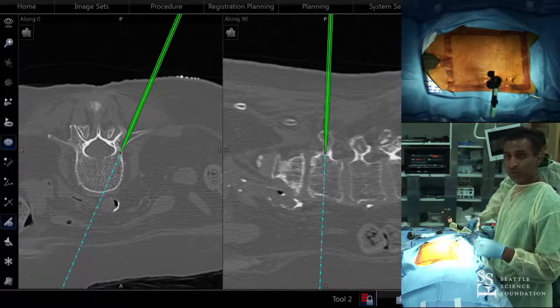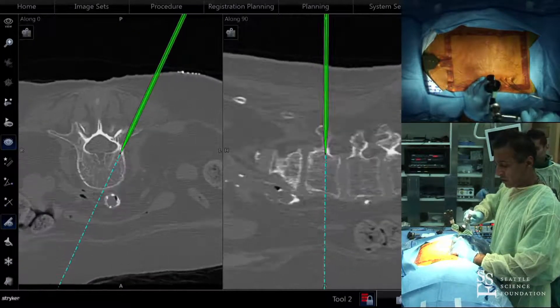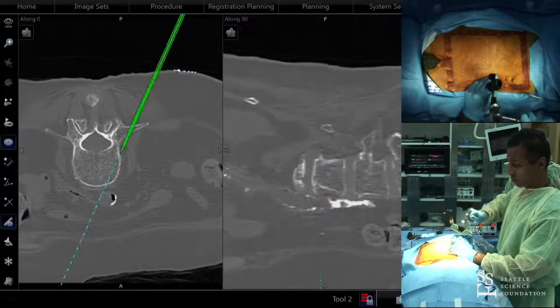When I do the TLIF first, I'll do it without guide wires — I'll just walk and navigate it all, and then put in the screws as if I'm putting in an open screw, because I'm watching the screw go right in on the navigation screen.